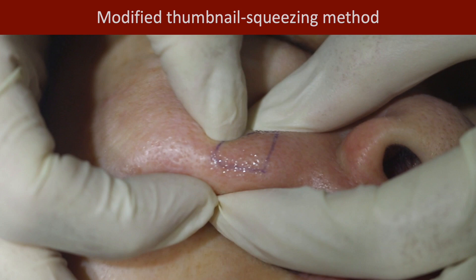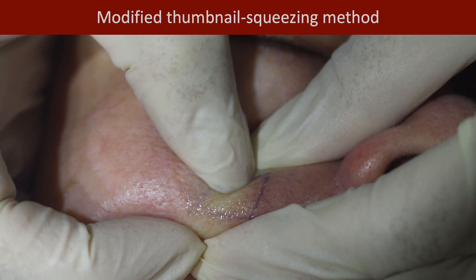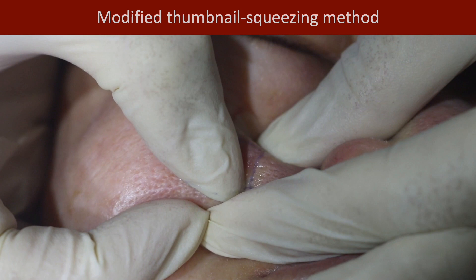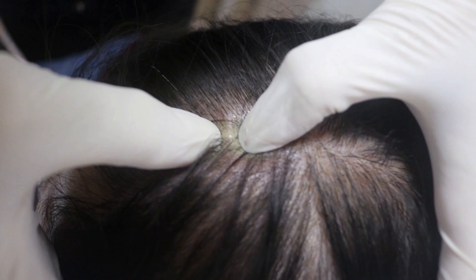Here shows a Demodex mite feeding on sebum. We also have a modified TSM without a pre-cut film dressing. Mark a one square cm area with a pen. Follicular contents can be collected from any skin area such as the nose, nasolabial folds, glabella, scalp, and the neck. Remember the key points for TSM: one square cm area, 0.5 mm in depth, and a convex surface.